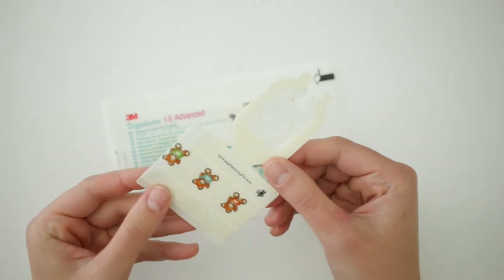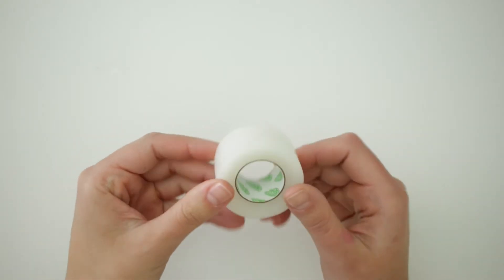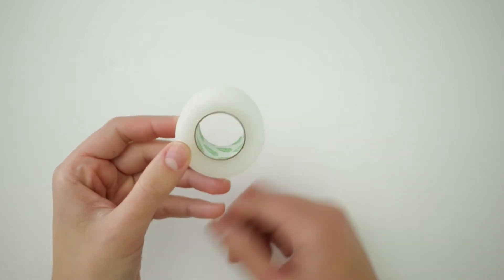Part of the INS standards and updates are that dressings must have a fabric border around the edge. So I grabbed one of these neonatal-sized dressings and I will replace the pediatric size that comes in the IV start kit. You'll also want to have additional adhesive tape. It's important that you use the sterile tape inside your IV start kit when taping anything around the actual IV insertion site itself, because there's a lot of pathogenic bacteria that can adhere to an adhesive roll at your patient's bedside. It's acceptable to use a roll of adhesive tape when taping the arm to the arm board, but anytime you're working around the insertion site itself, stick with that small sterile roll from your IV start kit.